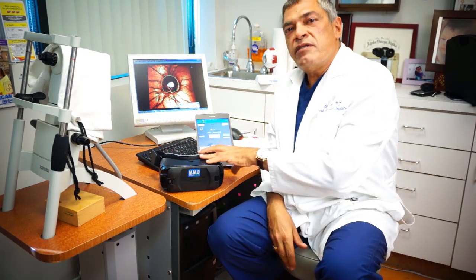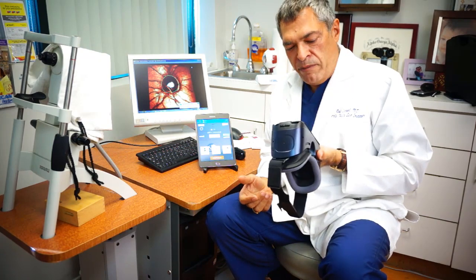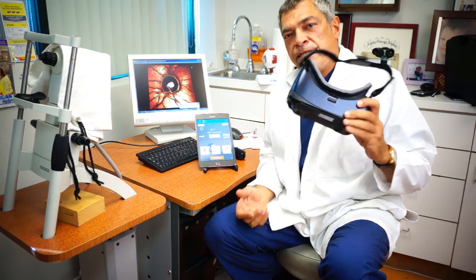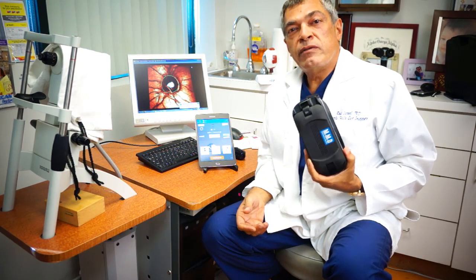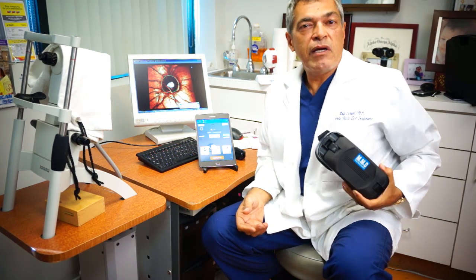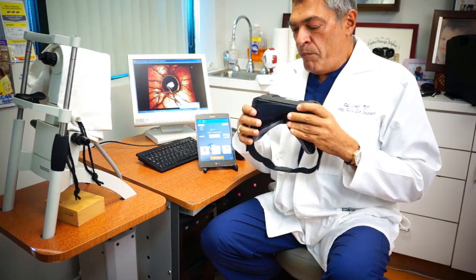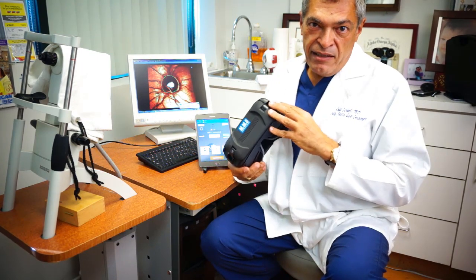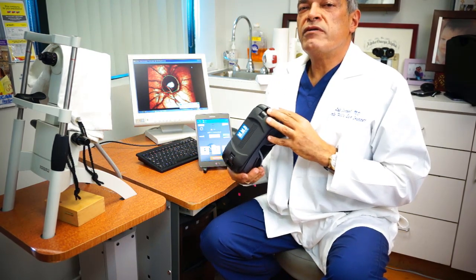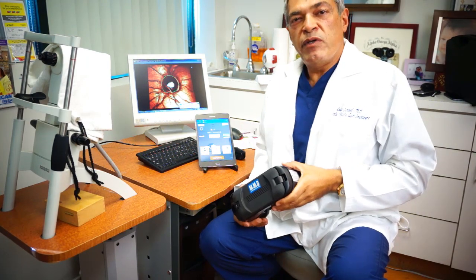What excites me about this virtual reality visual field analyzer is that in addition to producing reports that are virtually the same as big machines, it is portable, battery operated, and it can reach a lot of different patients that I was previously not able to access with my big machine.